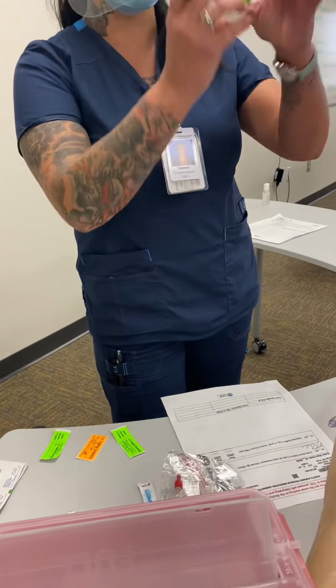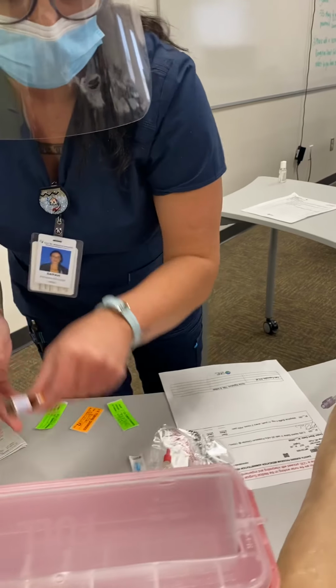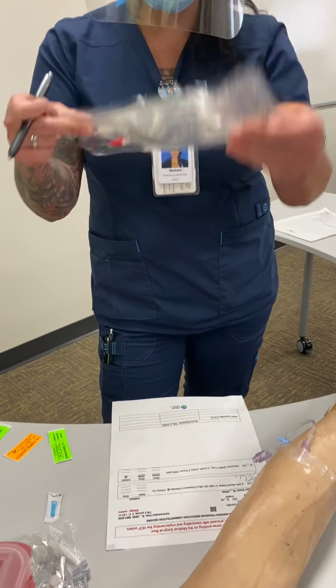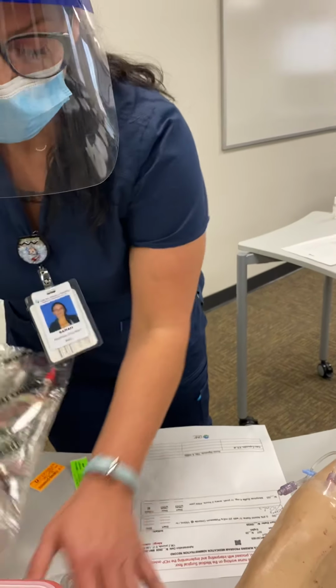It's not expired. Color looks good. It has not been opened. So that's good. And also just making sure I have the right saline to dilute that with, and it's good. It's not opened. It's not expired. It hasn't been tampered with, and it is the correct amount.